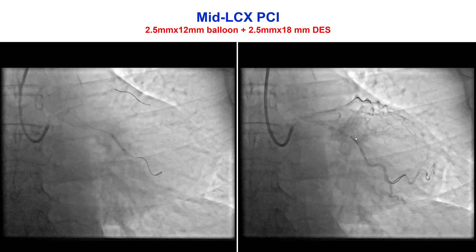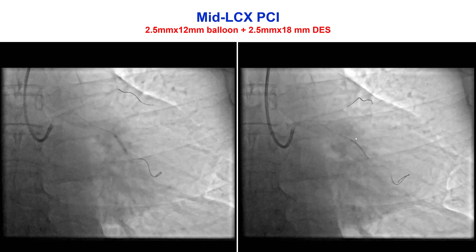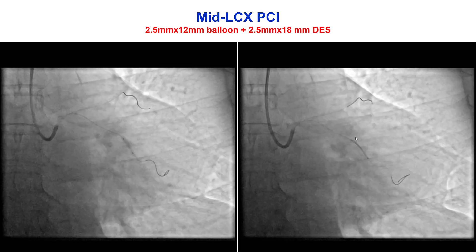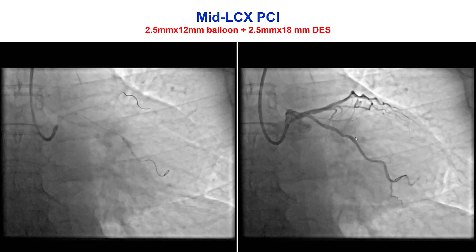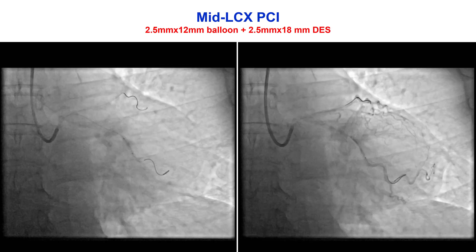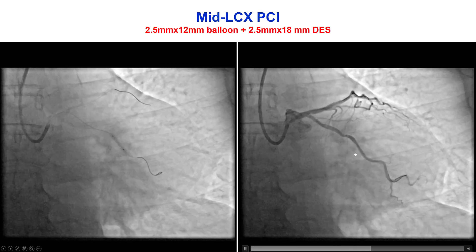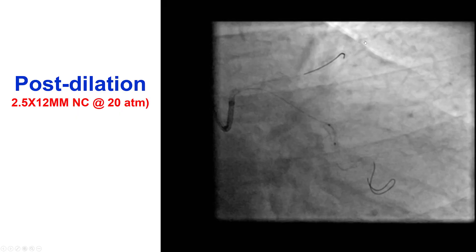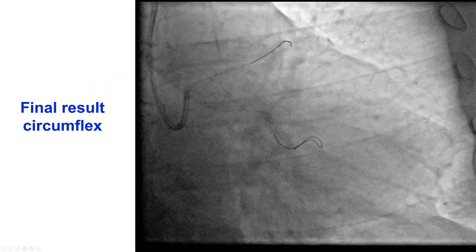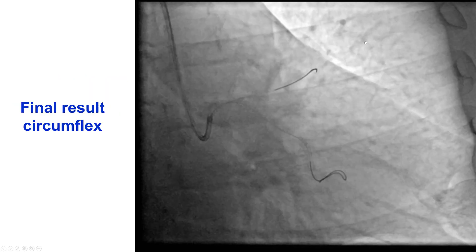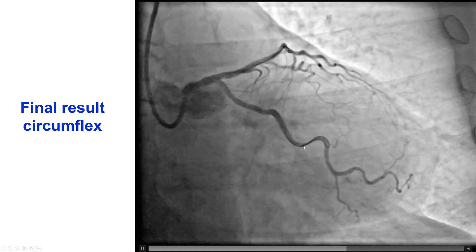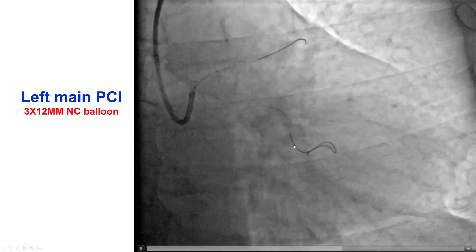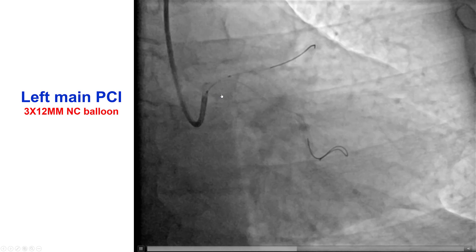Based on this and previous conversations with the patient, it was decided to perform PCI. The OM lesion was first successfully stented and post-dilated, and a nice result was achieved in the circumflex. Then the left main was pre-dilated.